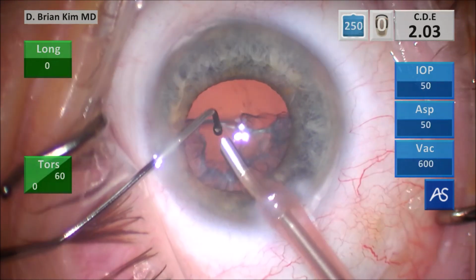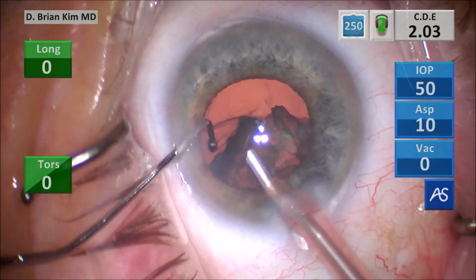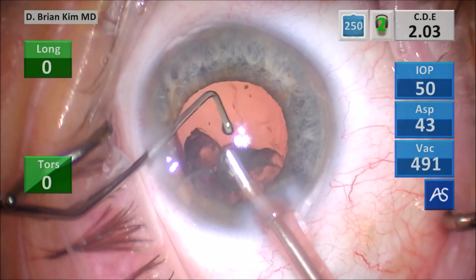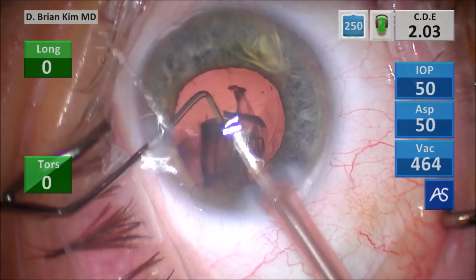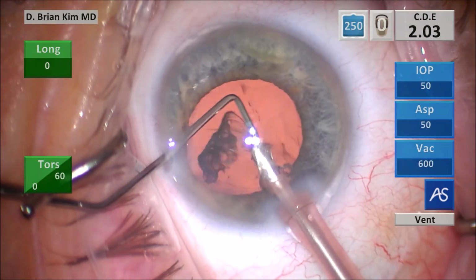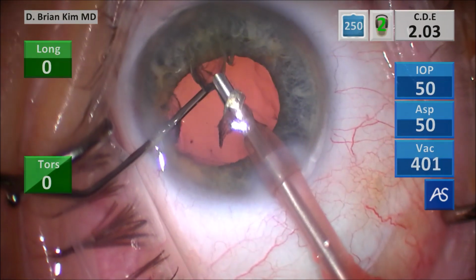So I'm able to get that piece of epinucleus there, and on the left side here, I'm able to grasp the edge of the epinucleus very safely without getting near the pupil as well. So those are the 4 tips of dealing with cases with intraoperative floppy iris syndrome.